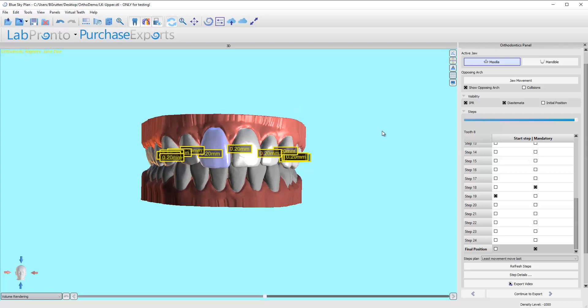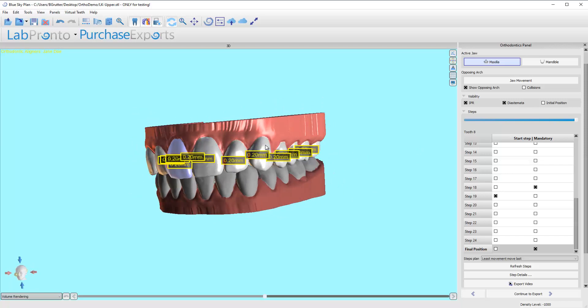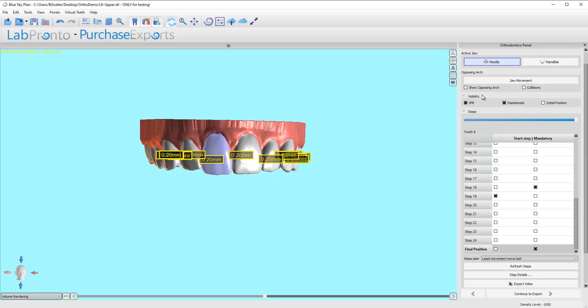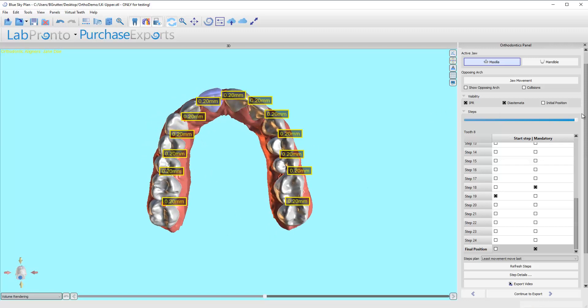We are now in the movement evaluation. As I mentioned at the tail end of that last video, I'm not surprised that it's as many steps as it is because we're doing a lot of arch development. We're widening out this upper arch, widening up the lower, and moving those posterior teeth takes a little while. So we just need to go through and do a movement evaluation and see how we're getting from A to Z.